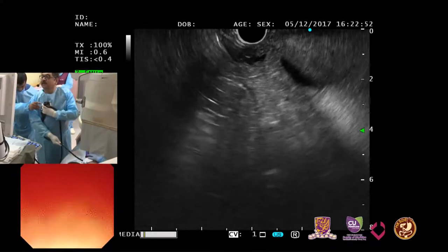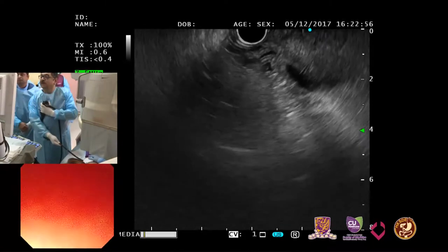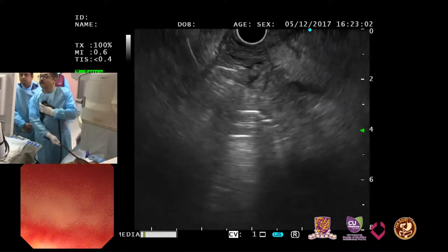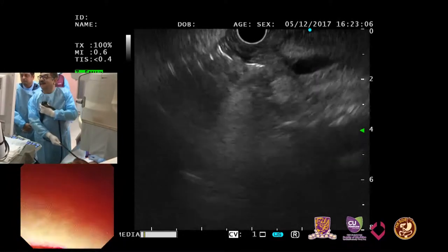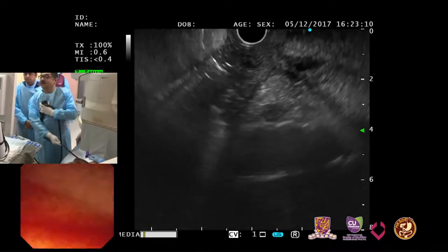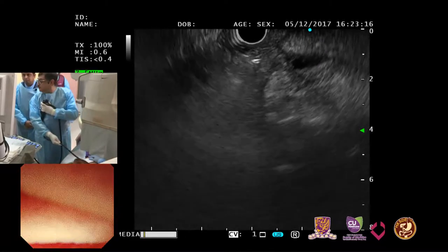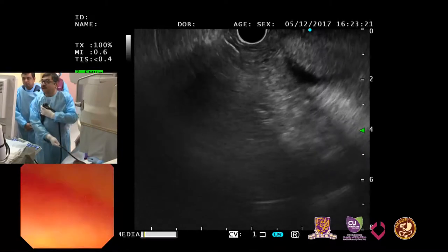So this is the papillary area. Raymond, you see anything? I am not really seeing any mass here. So is it a papillary stenosis? I am not seeing a mass here. Right. See here? Yes. This is a nicely seen papillary area. There is no mass here. So yes, probably papillary stenosis. Possible. She must be passing stones or some sludge or something. Right. She's an elderly lady.